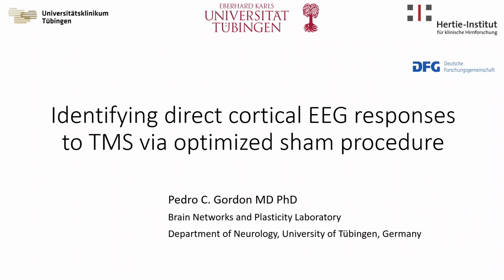And the interesting thing about that is that we can then probe a specific region of the cortex and get a response, which will then tell us something about the state of this cortex, and we can then compare maybe different interventions, we can compare different conditions that will tell us about what is the state of this cortex when we stimulate.